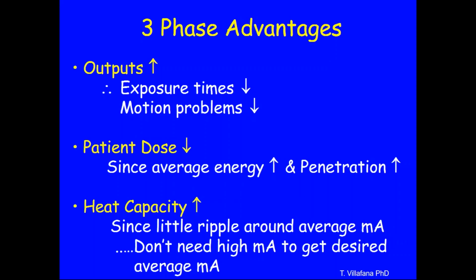advantages. You have an output advantage because since the waveform and voltage in MA doesn't go to zero with three-phase, well, then you have consistently higher MA and a consistently higher average energy. That means more output. That means less exposure time. That means less motion problems.